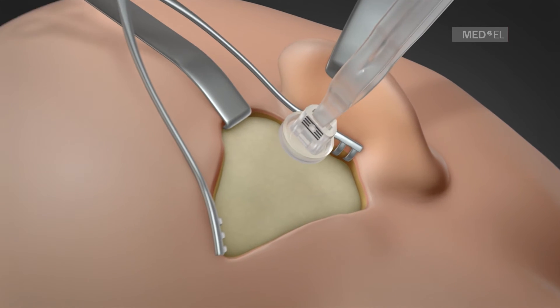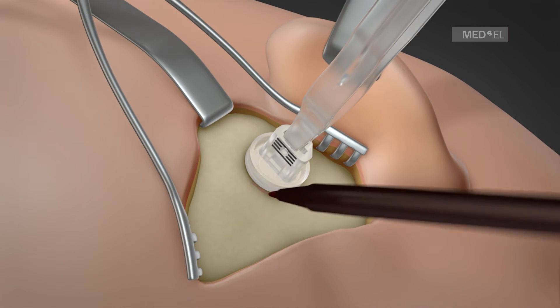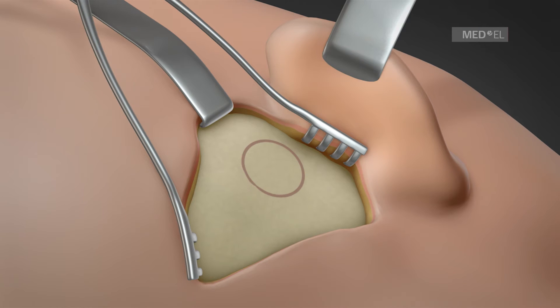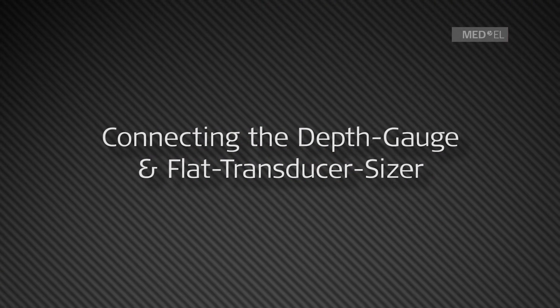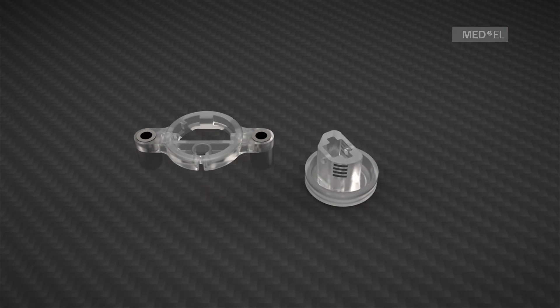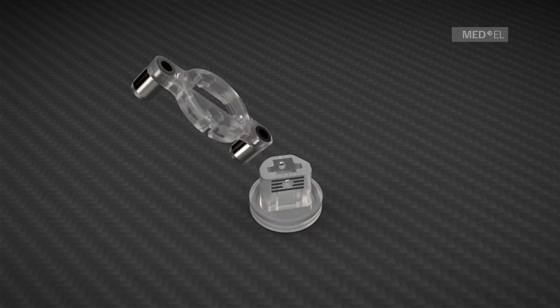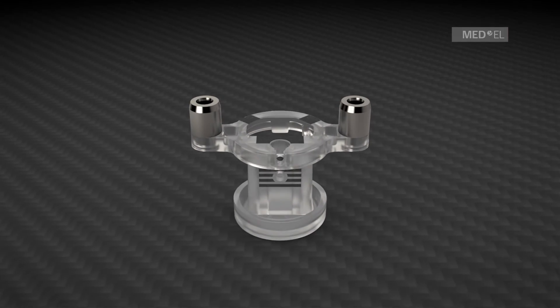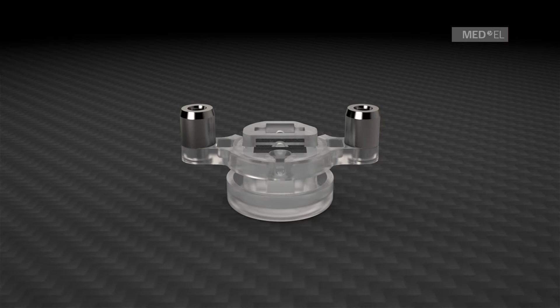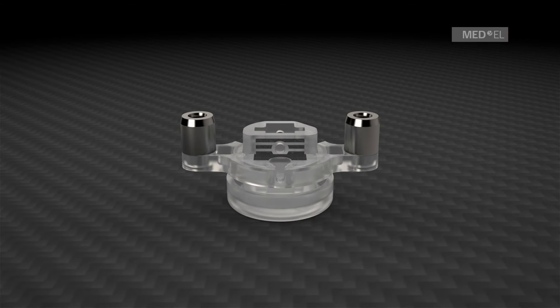With these templates, the position of the BCFMT is marked on the skull. The depth gauge assembly is put together by placing the flat transducer sizer over the depth gauge. It is then used to determine the size and drill depth of the bone bed for the BCFMT.